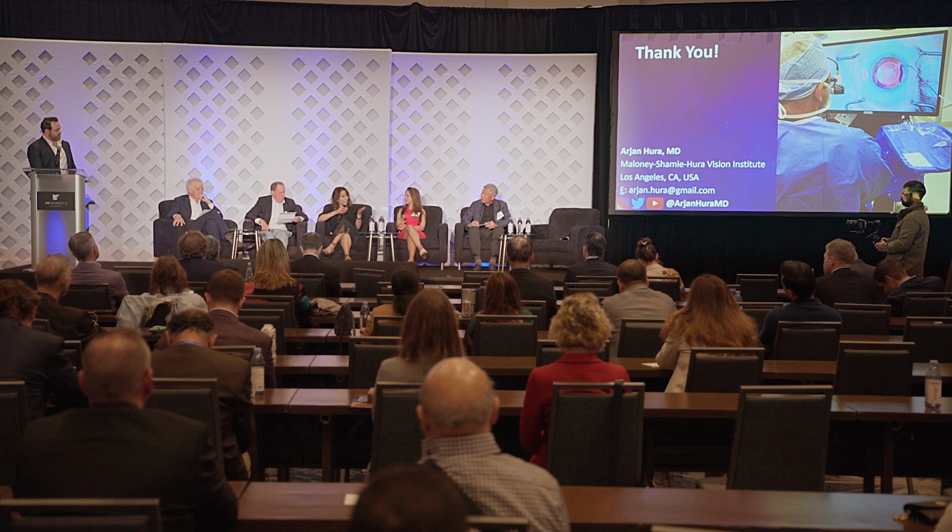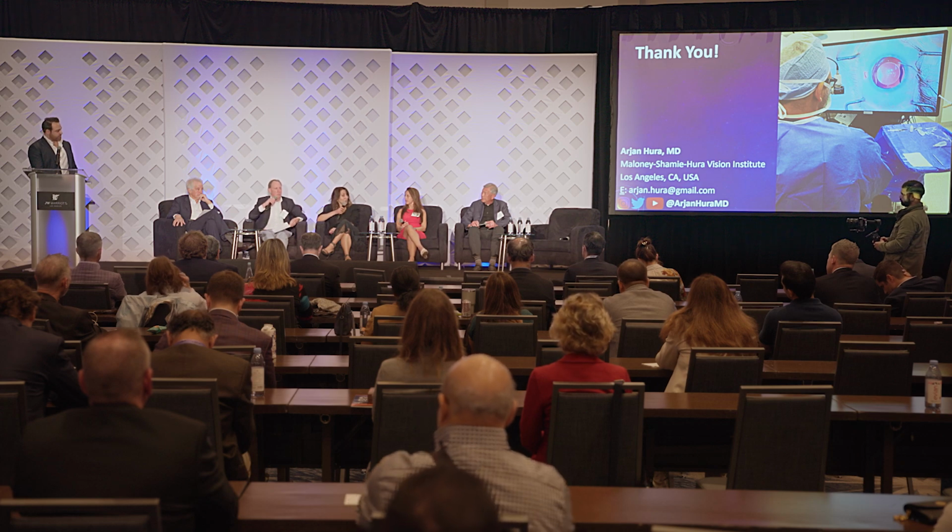And the question was, how long does it take? Usually I tell patients about 5 months. That is a 5-month course for the post-RK patients.